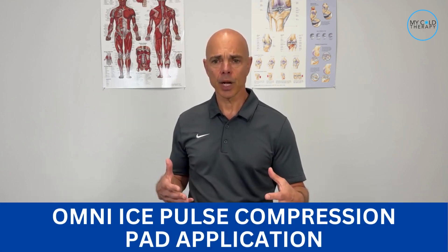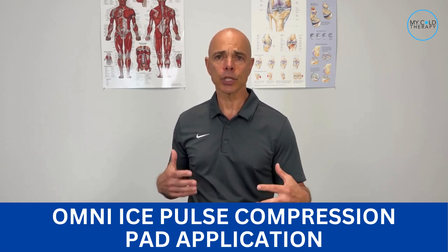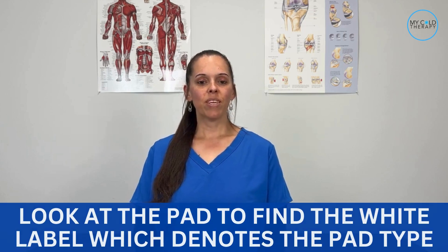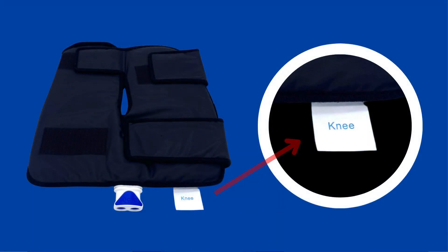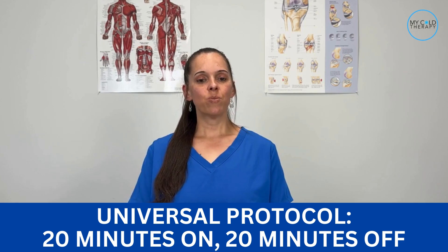Now, Michelle will take us through the application process for the pads of the Omni Ice Pulse Compression System. The first thing we need to do is make sure that the pad you ordered is correct. You would do this by looking at the pad to find the white label, which denotes the pad type.